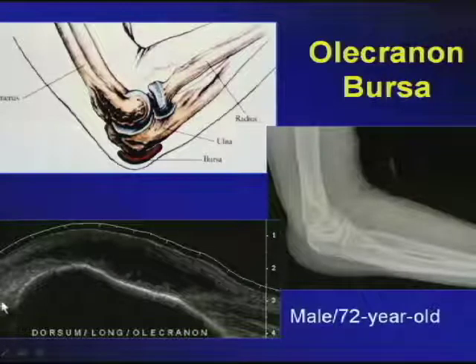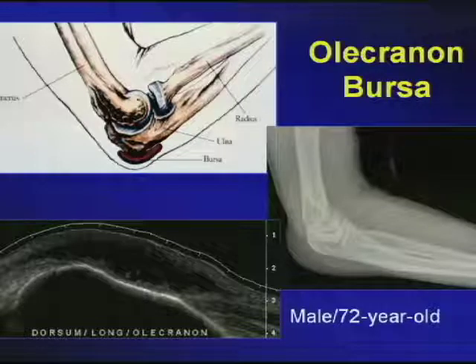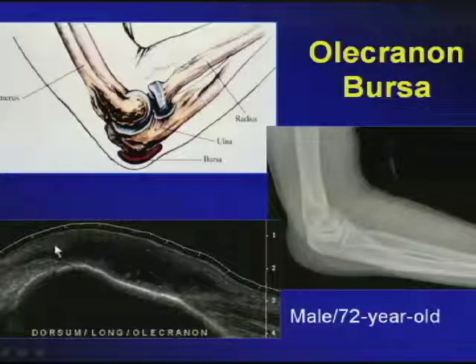Here you see the bone acoustic landmark of the olecranon process, and as we go distally on the proximal portion of the olecranon or ulna, you'll see that superadjacent to this is a distended, relatively hypoechoic bursa. And to add insult to injury, you'll notice that there are indeed some intermediate echoes within the intraluminal portion representing olecranon bursitis.